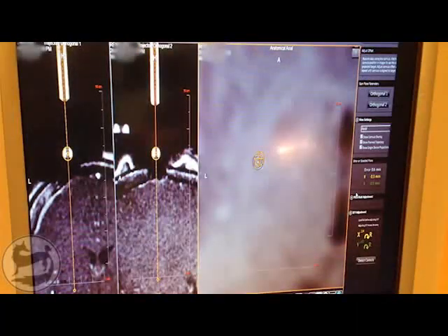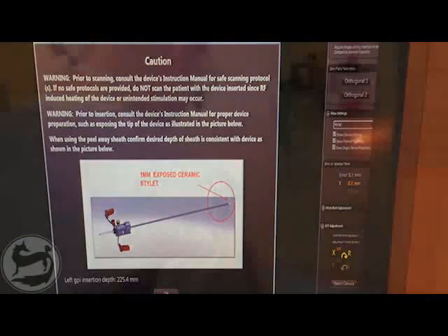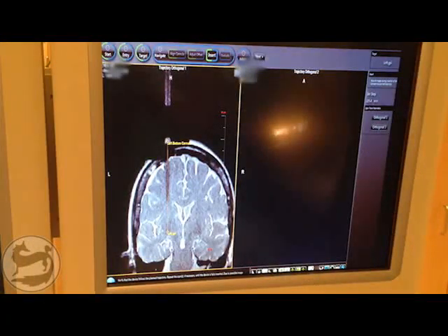Roll orange 7/8 to the right. The XY adjustments are made last to fine-tune the trajectory. The depth of placement is verified by the software. A ceramic stylet is slowly advanced to target, with interval scans verifying proper trajectory.